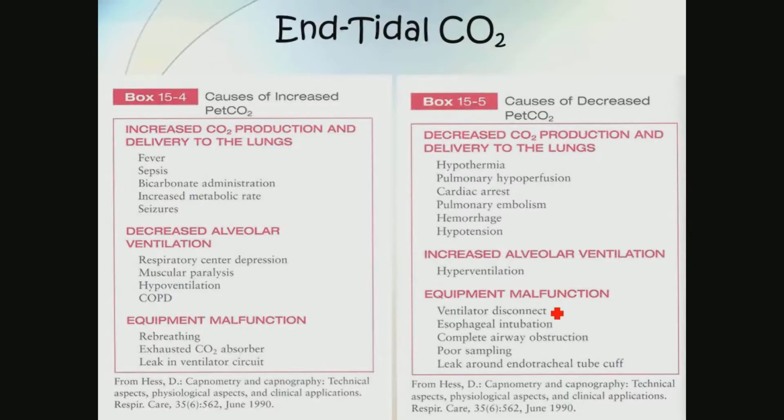I don't know if I blew this up for you in the back. I think I did. If not, this is something that's out of Miller Chapter 15. You know, that red book. It basically is talking about different reasons why you might have an increase or a decrease in end tidal CO2. Did I not? No. Okay. Well, there it is. It's in Miller. So it might make a good test question when we come around to it.